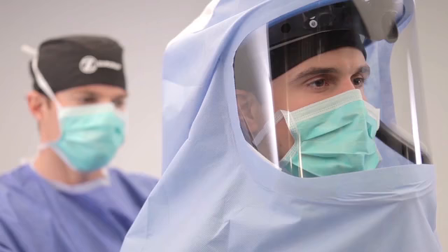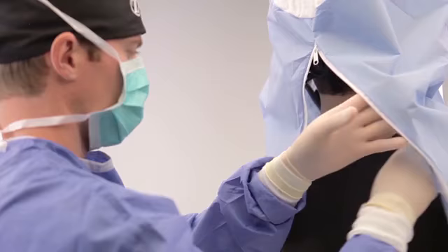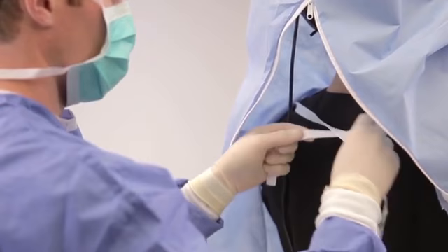Insert your arms into the toga sleeves. Have your non-sterile surgical mask untied and removed. Be careful not to contaminate the outer surface of the toga while removing the mask. Grasp the inside of the toga, pulling material together at the shoulders and neck. Then secure the inside ties of the toga at the neck.